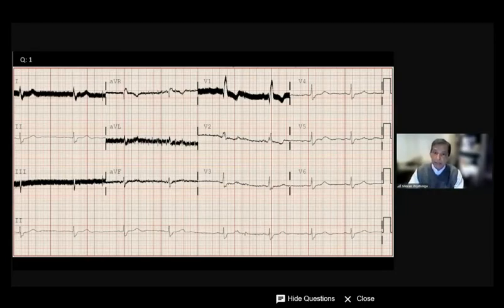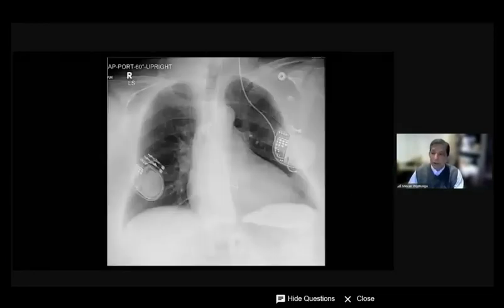But this is a case where the patient had a so-called... I know this may not be common in Sri Lanka, but just to know, this patient had this. This is not a pacemaker. This is a deep brain stimulator implanted for Parkinsonism, and this lead goes to the brain. There is a similar one implanted on the right side, but there was no wiring connection. But this is not uncommon. People usually get bilateral implants and one connected to the brain.